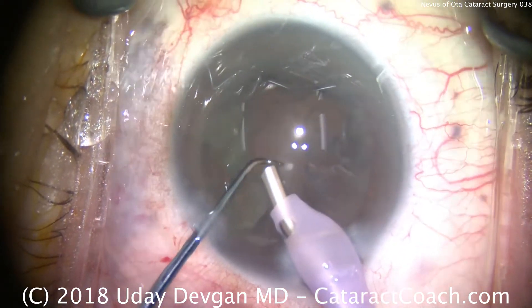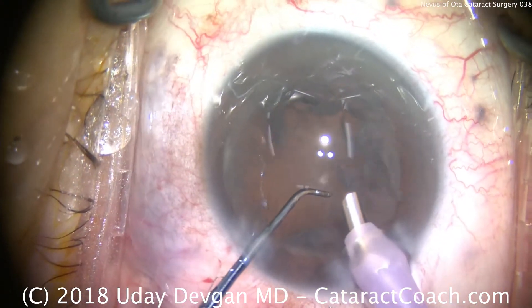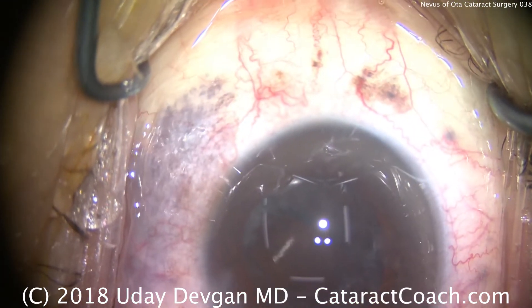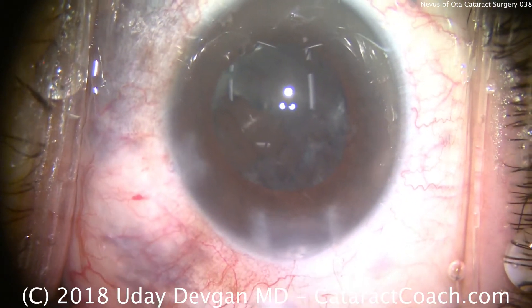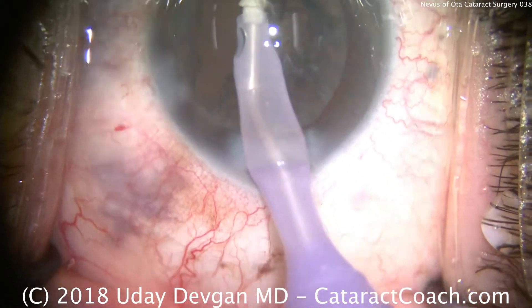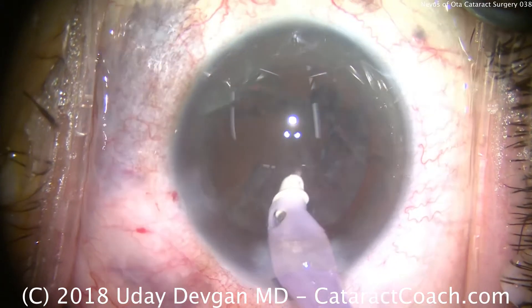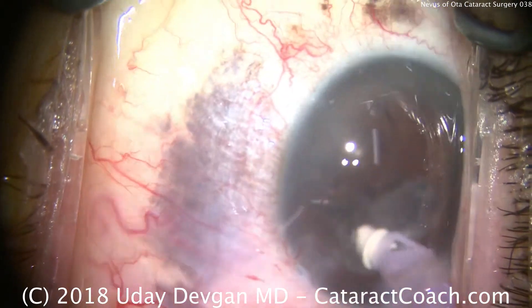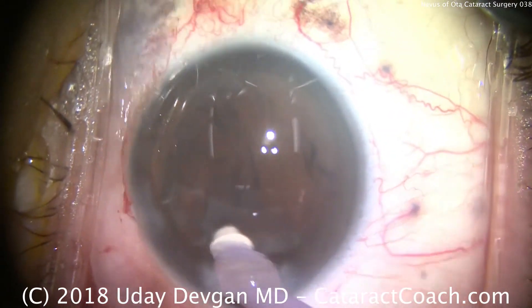Here's the last of the nucleus being removed, and we're ready for irrigation and aspiration. We're going to use the I/A probe to remove the cortex, and we want to be really gentle here. While the nevus of Ota is not typically associated with other structural abnormalities in the eye, you just never know. The nevus of Ota is associated with a very low risk of ocular melanoma, and is sometimes also associated with cataract or glaucoma.